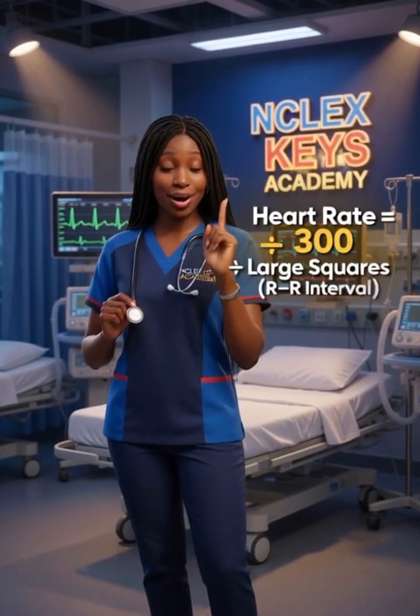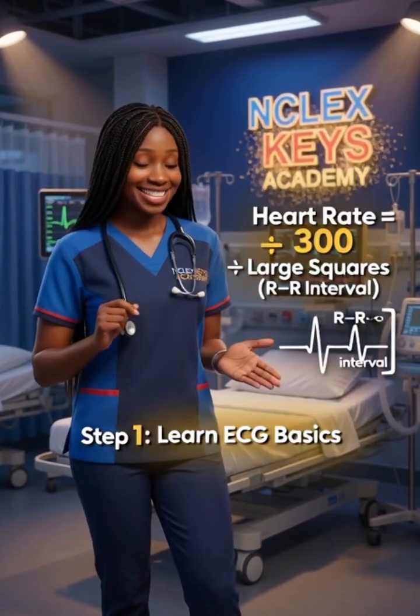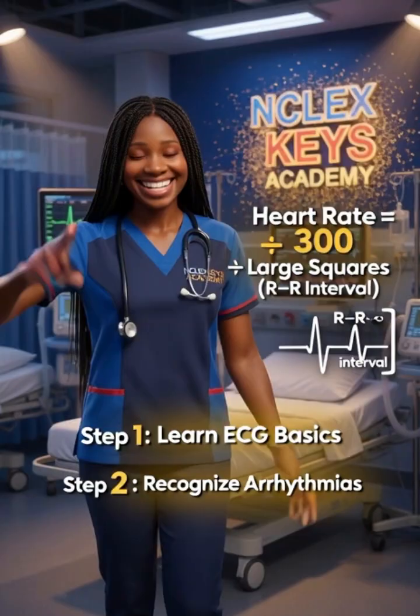Use 300 divided by large squares between R waves to calculate heart rate. Understanding these ECG basics is your first step to recognizing cardiac arrhythmias on the NCLEX. Keep studying hard. Your success is coming.